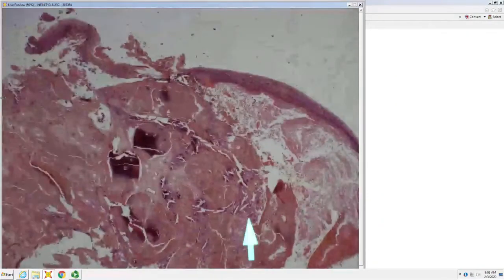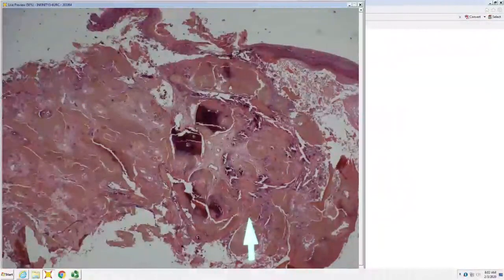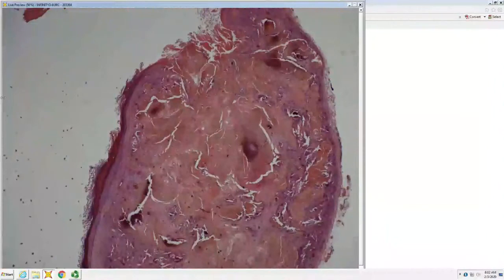Oh, pilomatricoma. Pilomatricoma, a little slow, but otherwise very good. You get the easy button. So in pilomatricoma, you see calcification, and you see ghost or shadow cells, and sometimes basaloid cells as well. Toast, what's it then?